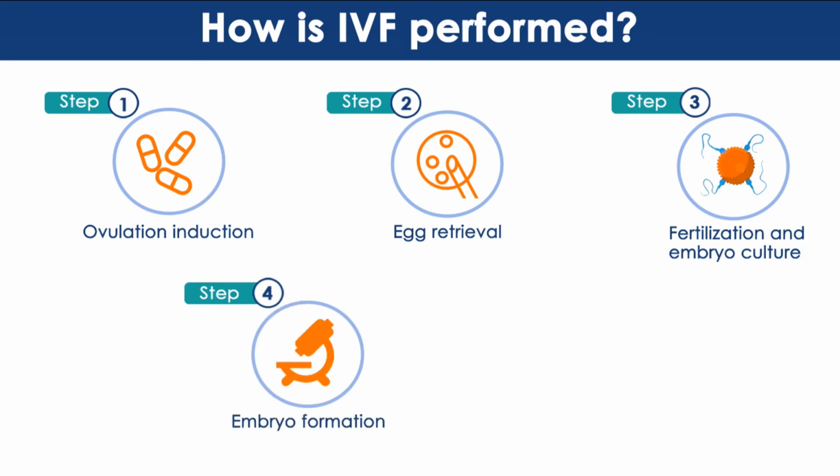Step 4. The subsequent process of embryo formation is closely monitored. The quality of the embryos is assessed to rule out any disorders or abnormalities. The healthiest and strongest embryos are identified for transfer.